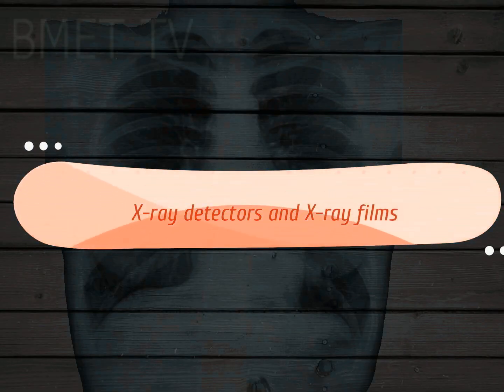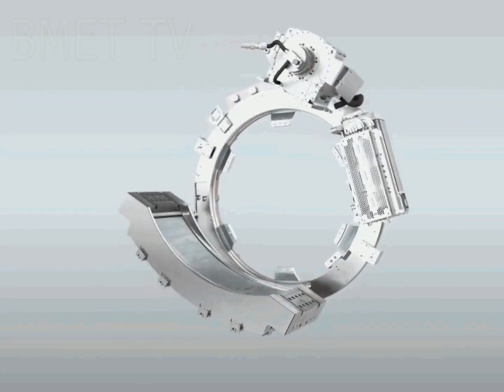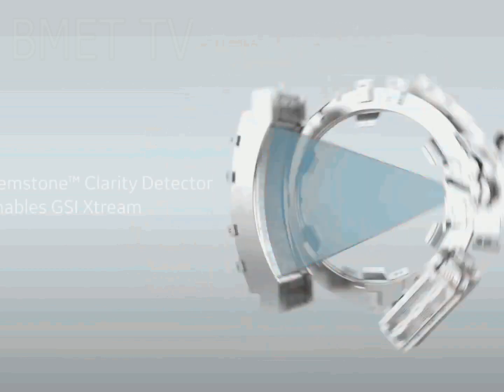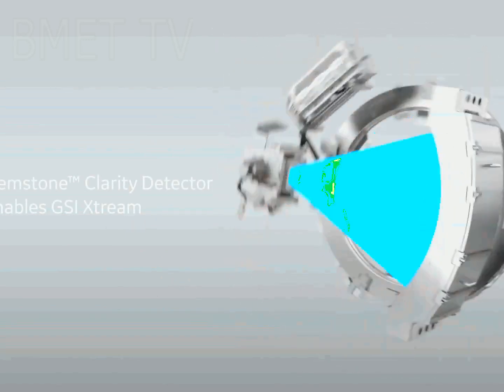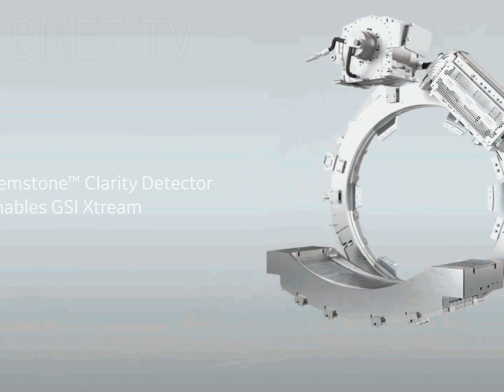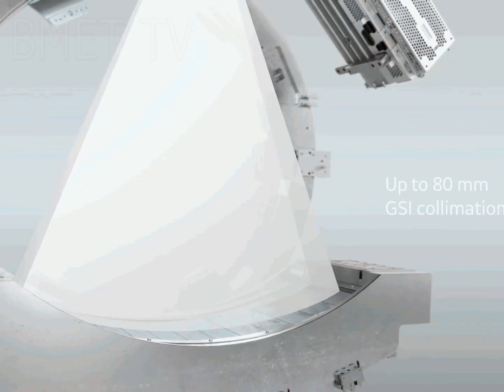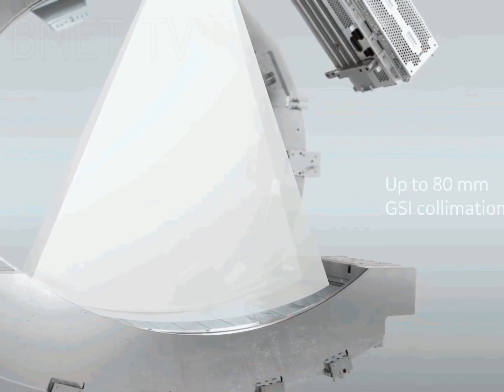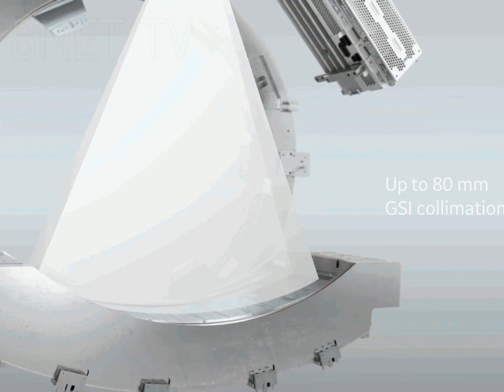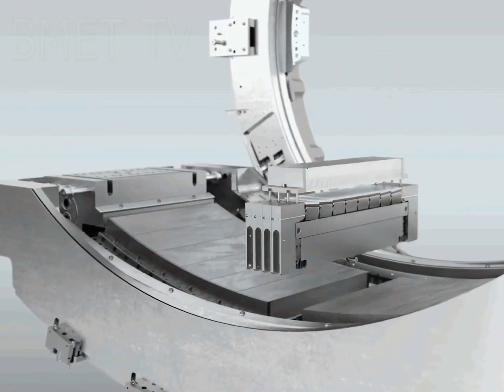Let's wrap up with X-ray detectors and X-ray films. Perhaps the most common type of X-ray detector uses an electric current to measure incoming X-rays. In this type of detector, an X-ray interacts with a material, freeing an electron. That electron can rattle around in the detector and give energy to other electrons. In some materials, these electrons will have enough energy to be freed of their host atoms. In that case, applying an electric field will allow those free electrons to be collected and counted. The number of electrons collected tells you the energy that was deposited.